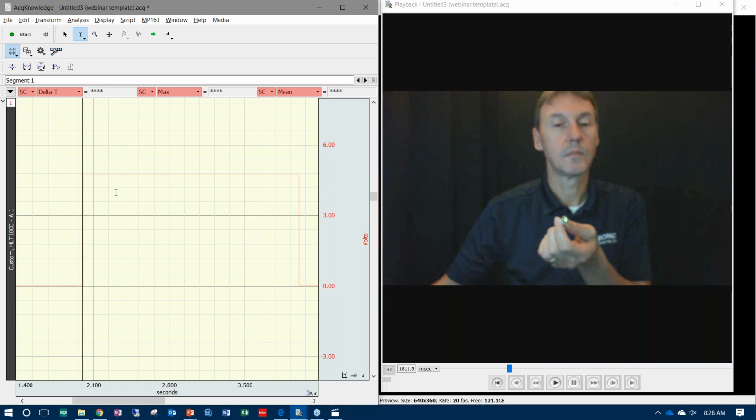That tells me that the video is now synchronized with the physiological data. So any other signals that I was collecting at this point, I know that what I'm looking at on the video is now perfectly aligned with the physiological data that I've collected.